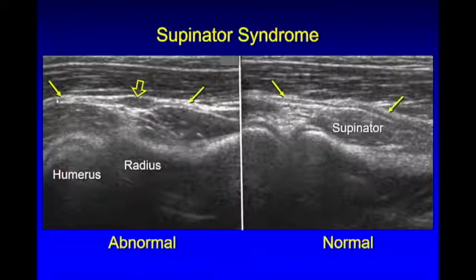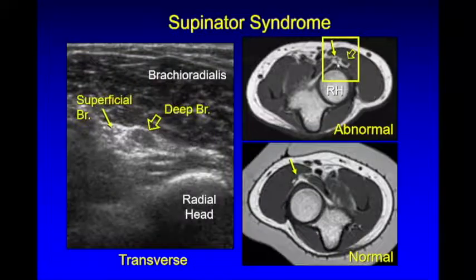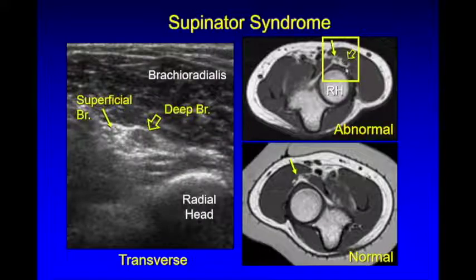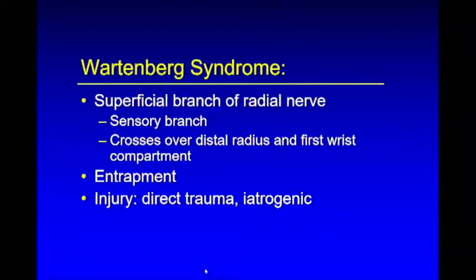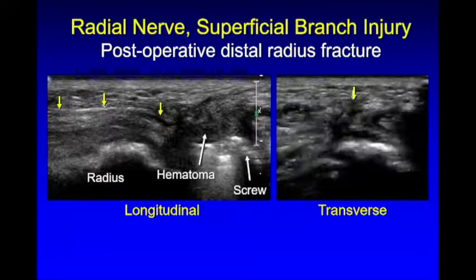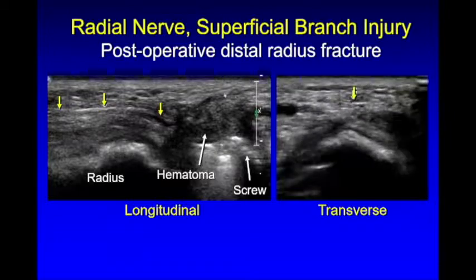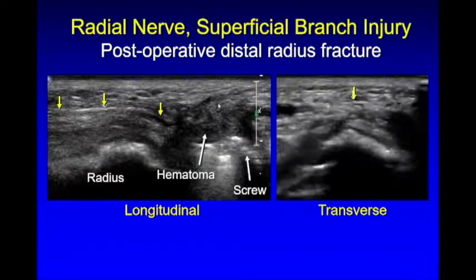As the deep branch enters the supinator between its two layers, we see hypoechoic enlargement at and proximal to the entrapment site. Here is the contralateral normal side. Here in short axis is normal, and here is the abnormal nerve enlarged proximal to the supinator — the deep branch markedly enlarged. Wartenberg syndrome involves the superficial sensory branch of the radial nerve at the level of the wrist, where it crosses over the first extensor compartment. It's prone to injury from phlebotomy or IV placement, or entrapment — as in this case with a radial fracture and plate fixation, where the superficial branch is going right into scar tissue.